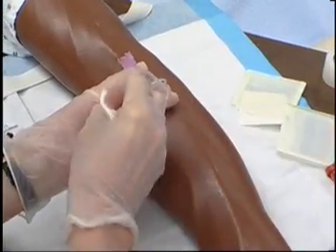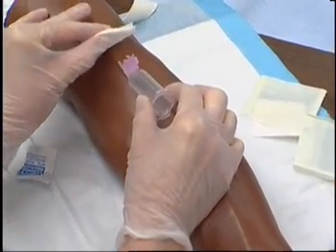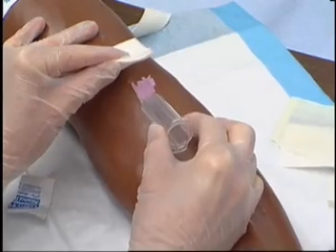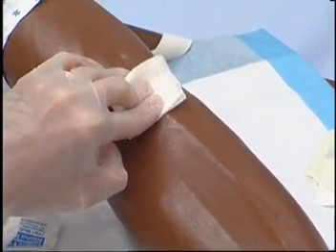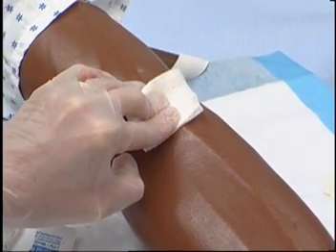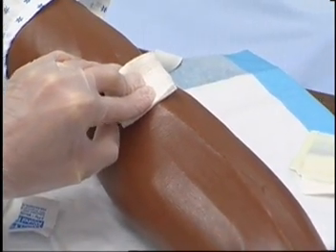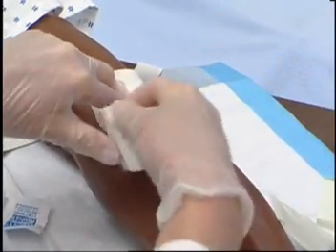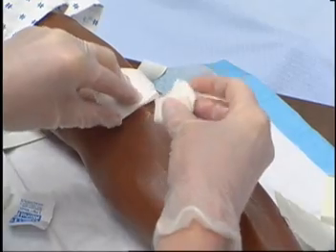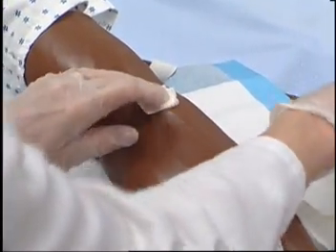Place sponge above needle site and remove needle. Apply gentle pressure to site. Do not apply pressure until needle has been removed. Hold sponge on site for 2-3 minutes, or longer if client is receiving anticoagulant therapy. Apply adhesive or gauze bandage if necessary.